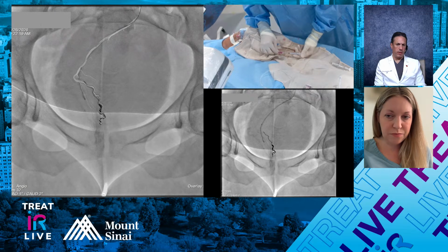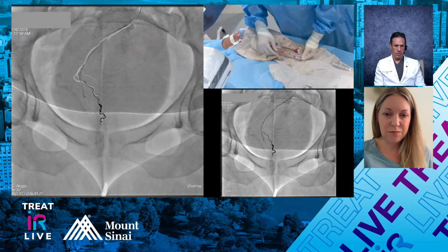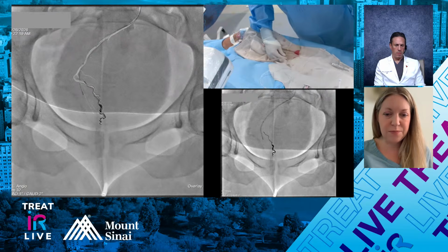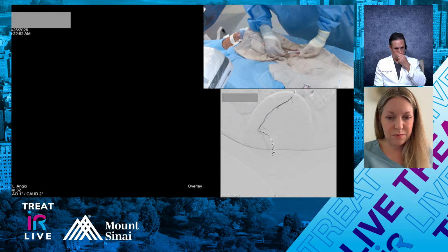that it's probably less likely to cause any ischemic issue, even if it refluxes into some of these other more proximal branches, which I'm sure particles at that size would, just given how small the vessel is. Yeah, you can kind of see the blush from that middle rectal there, right?